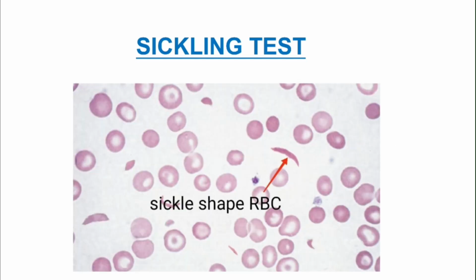Hello friends, in this video I am going to explain about sickling test. In this image we are seeing RBCs, which are normal in shape, and some crescent shaped RBCs. Sickling test is basically about diagnosis of these sickle shaped RBCs.